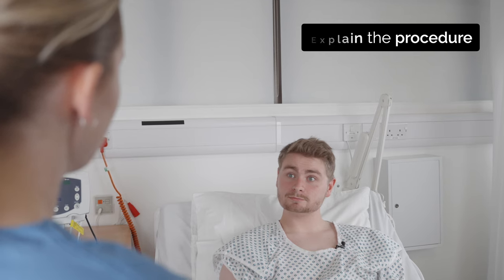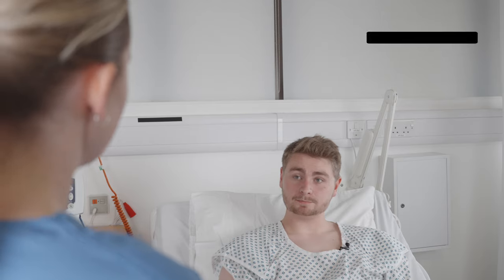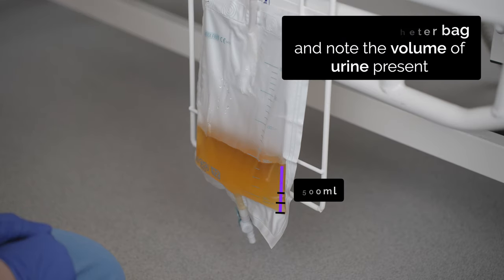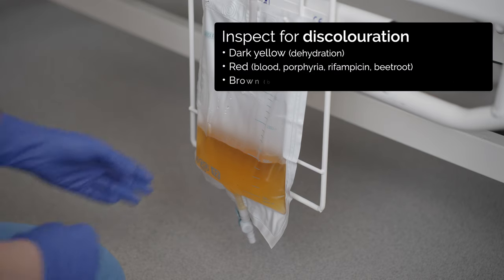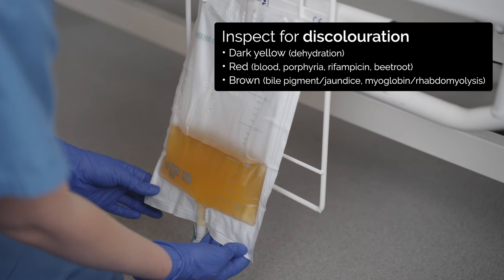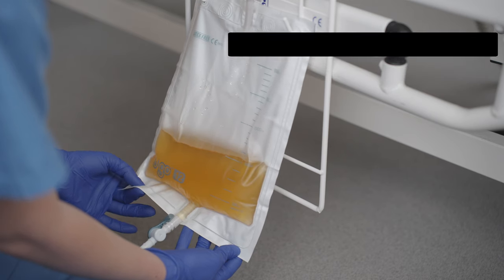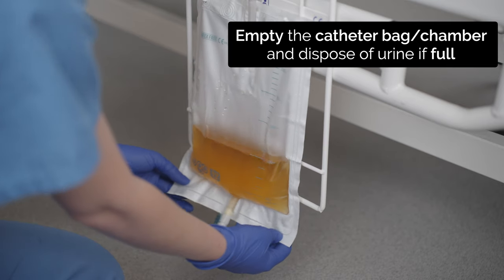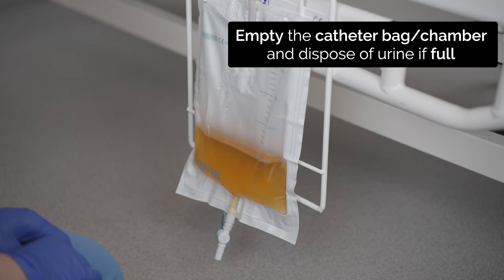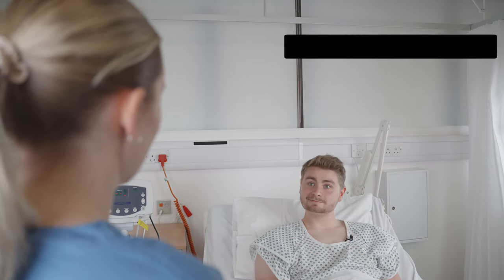So today I've just been asked to check your urine output, so I just need to have a quick look at your catheter if that's okay? That's fine. Thanks. Okay, that all looks fine, I'm just going to go and document that now.